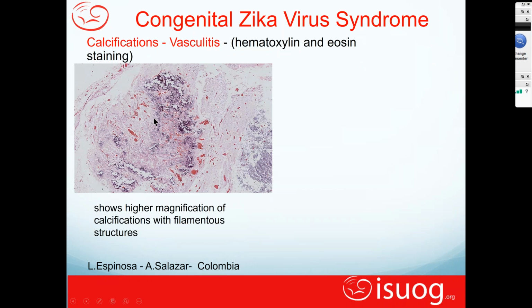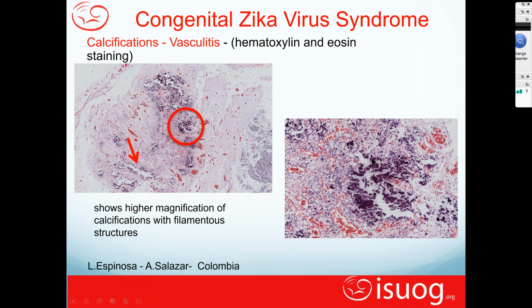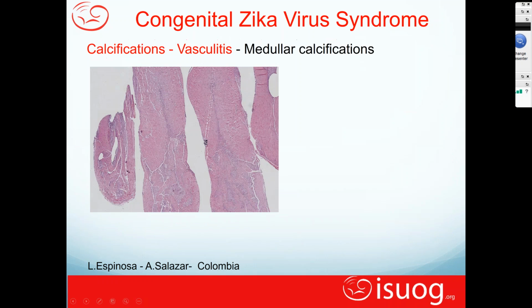When we look at this vasculitis, you can see the changes with the higher power magnification in the walls of the vessels, where white cells are coming in. As you can see, it's circled here, and it shows up in the vessels in this area, characterized by the macrophages and the white cells sitting in the area of the vessels within the brain, as we saw these calcifications on ultrasound.